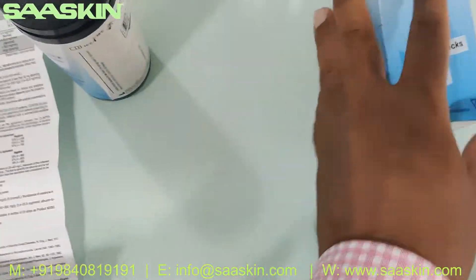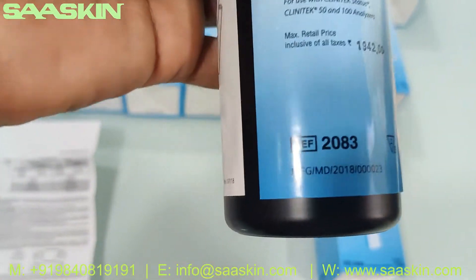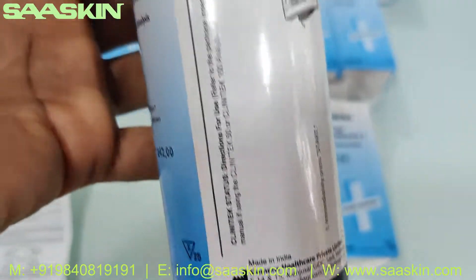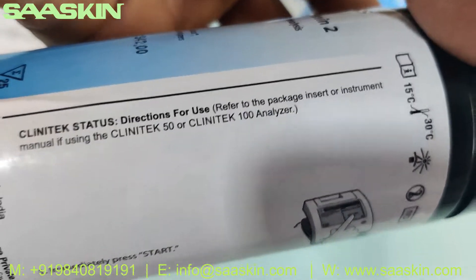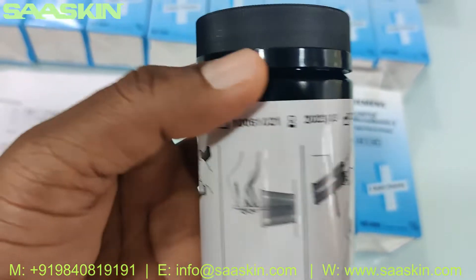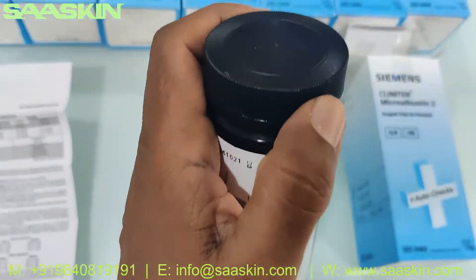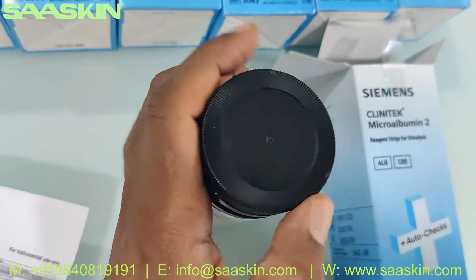Let me look inside the box — this is how the bottle looks like. The instructions for how to use it on the machine are also printed on the outside of the bottle. Let's open this bottle. Each bottle contains 25 strips.